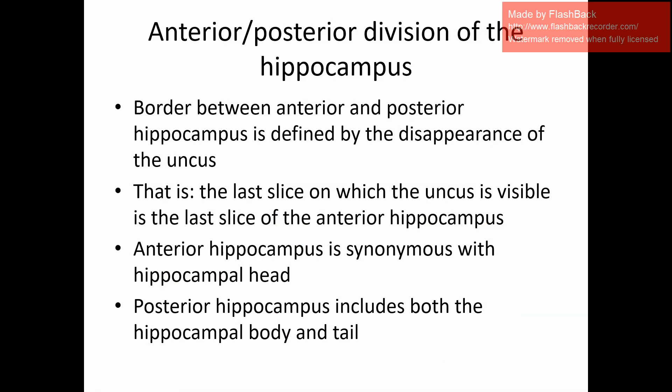So how do we use the uncus? The last slice on which the uncus is visible is the last slice of the anterior hippocampus. For this particular rule, the anterior hippocampus is synonymous with the hippocampal head, and posterior hippocampus includes both the hippocampal body and tail.